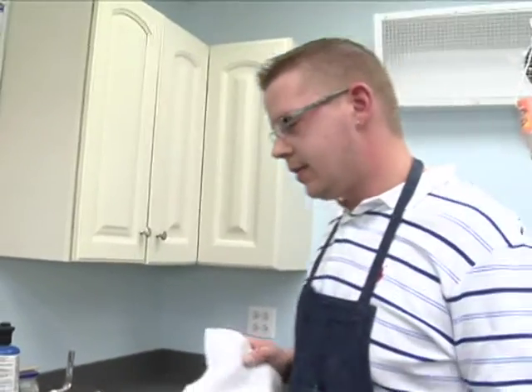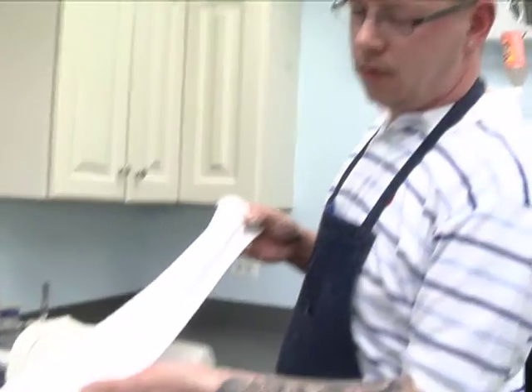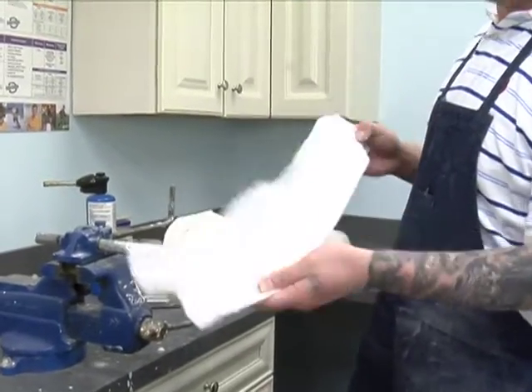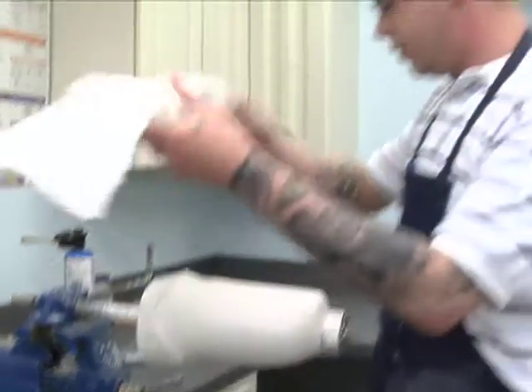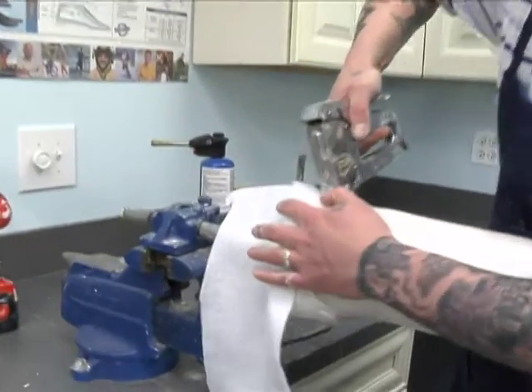Now that our cast is sealed with the cellulose, we'll go ahead and add a piece of Dacron felt, which you can also get at any local prosthetic retailer. We'll use this on the top to prevent the cast from getting sealed off when we attach our PVA bag later.